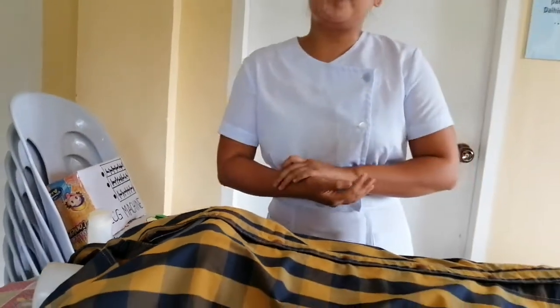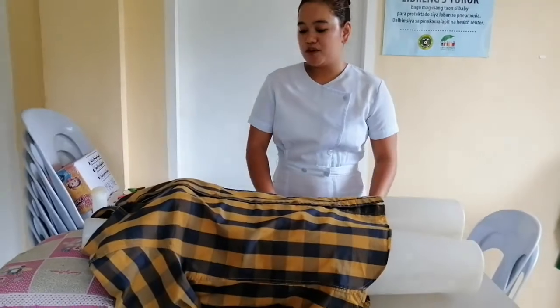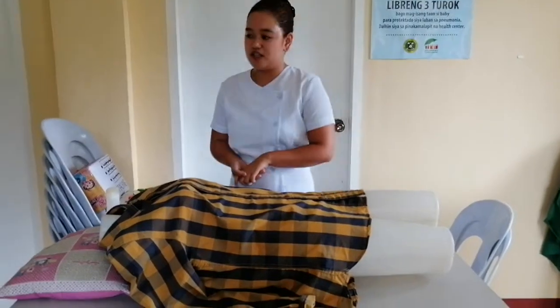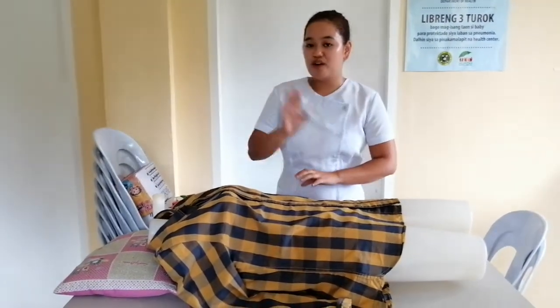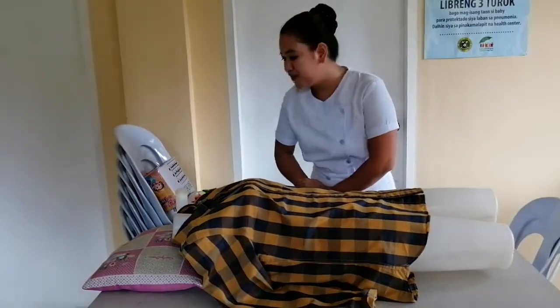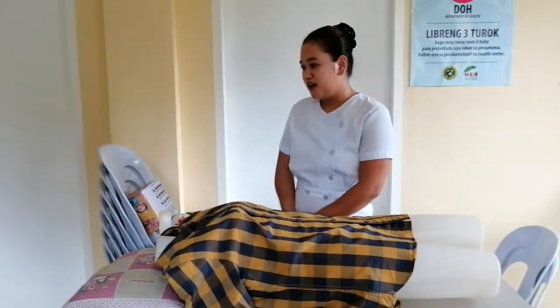So, let's move on to the proper demonstration of the different steps of this ECG procedure. The first thing to consider is to review the patient's condition, the patient's history or current condition. Also, we need to obtain information from the client on the need for the ECG, why the client needs to undergo an ECG. So, I'm going to ask my patient, "Good morning, ma'am. Sinabi po ba ng doktor niyo na mag-a-undergo kayo ng ECG?"